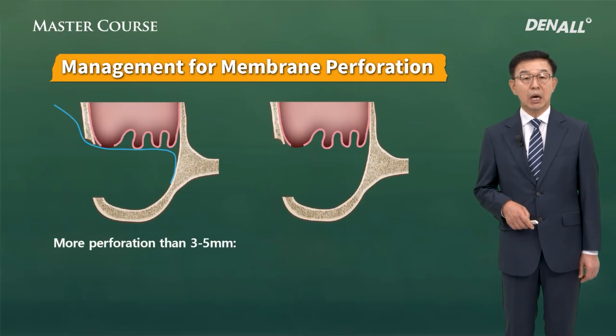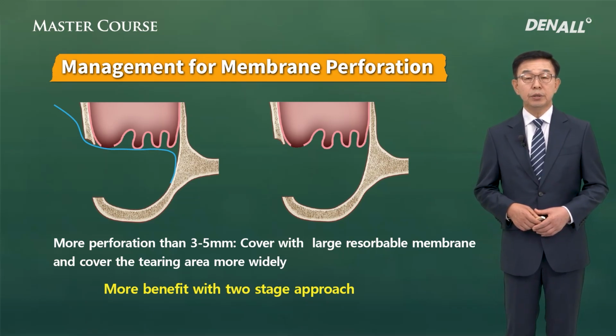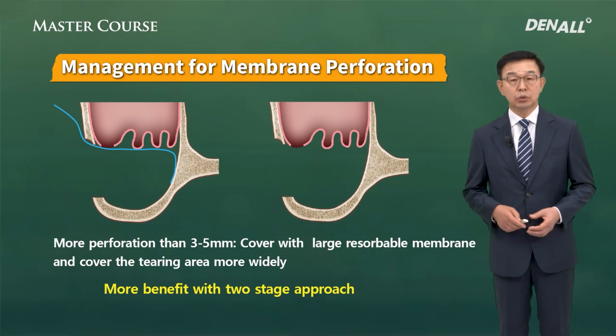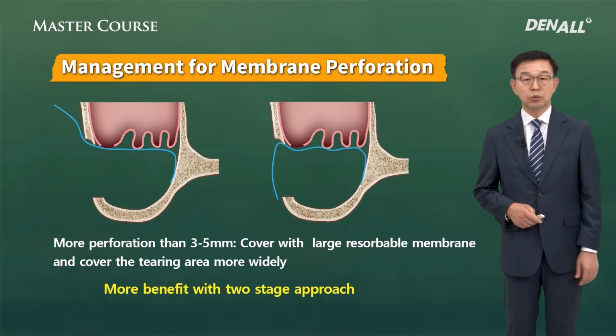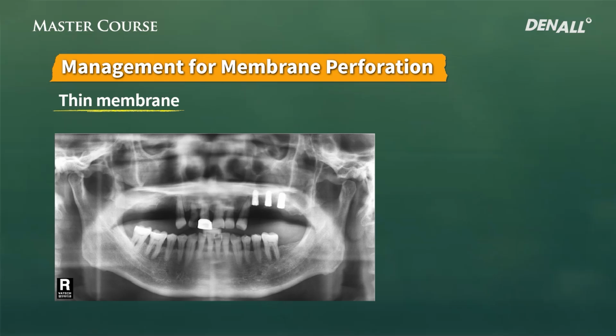If it is between 3 to 5 millimeter, or if it is beyond 5 millimeter, you need to use a large resorbable membrane to cover the torn area. This needs to be done sufficiently. Let me give you an example.